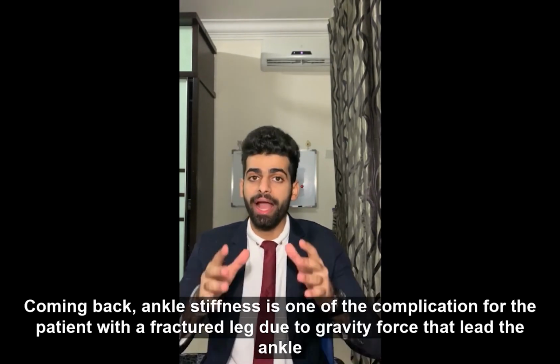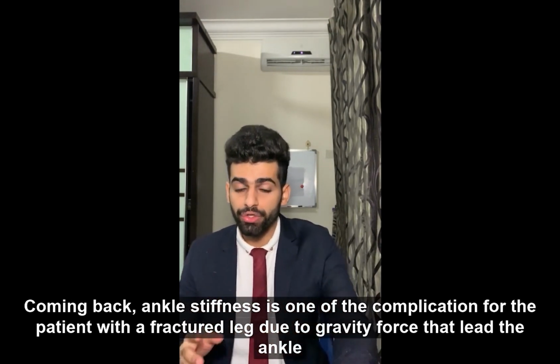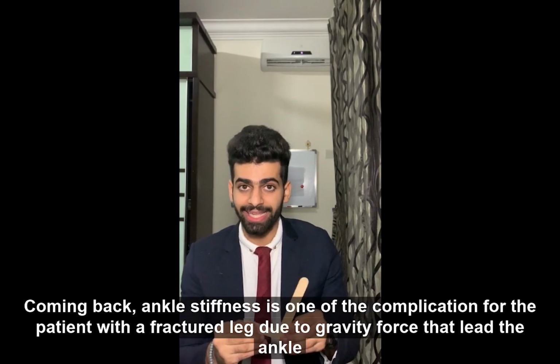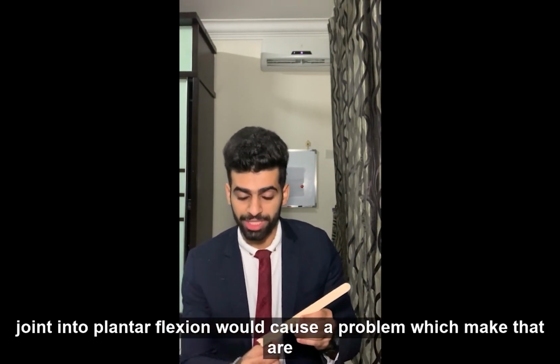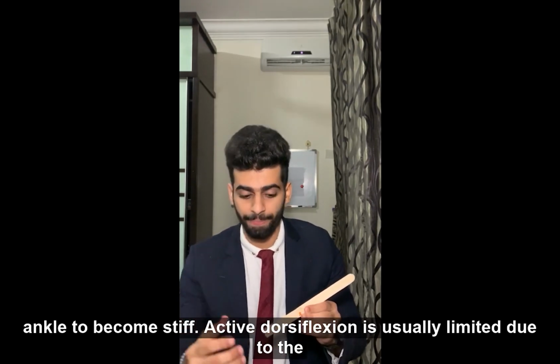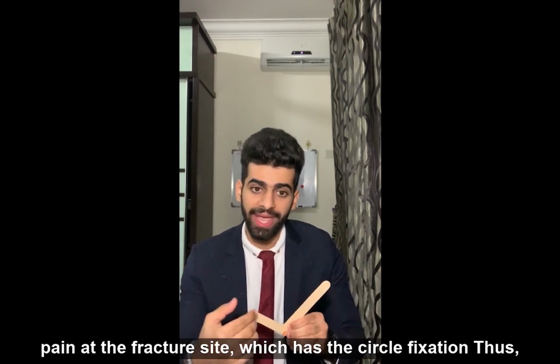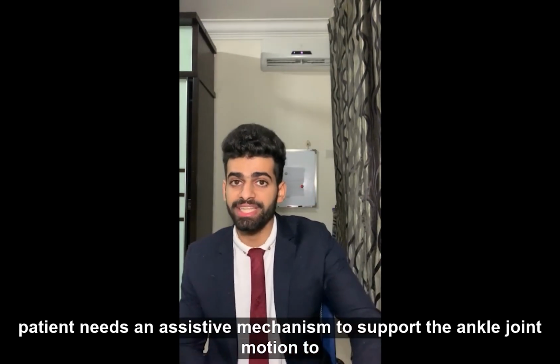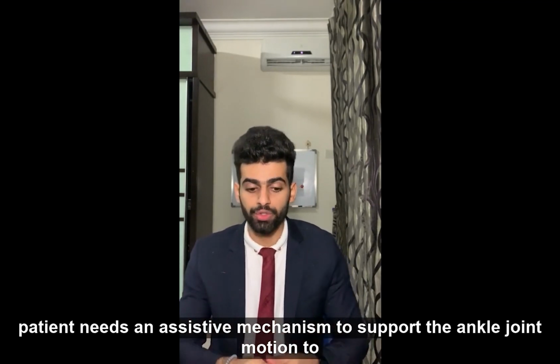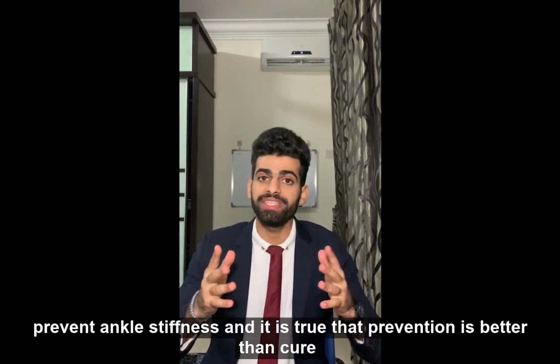Coming back, ankle stiffness is one of the complications for patients with a fractured leg. Gravity force leads the ankle joint into plantar flexion, which makes the ankle become stiff. Active dorsiflexion is usually limited due to the pain at the fracture site, which has the circular fixation. Thus, the patient needs an assistive mechanism to support the ankle joint motion to prevent ankle stiffness.